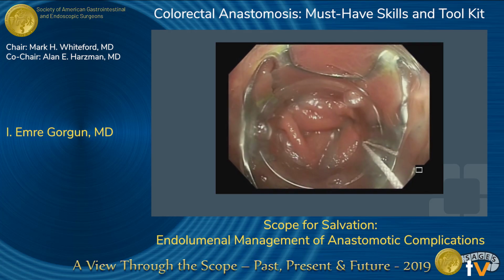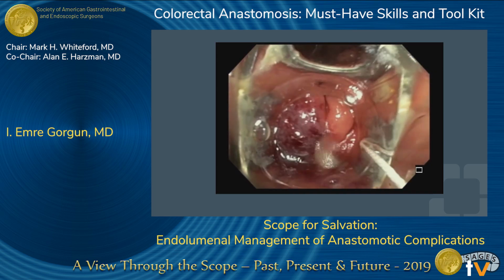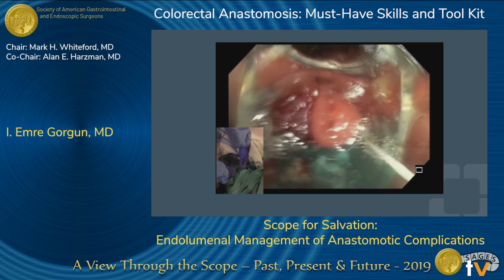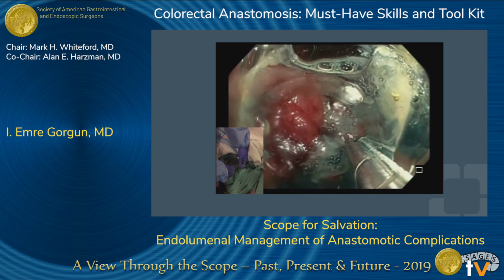It's a little bit larger, the tips, but you can easily still get up to 30, even to the cecum area, and I've closed many defects with this successfully. And here I used, again, injection from the outside. You can exactly see where you need to close. And here I used an anchor tip, which is a different type than the twin grasper.